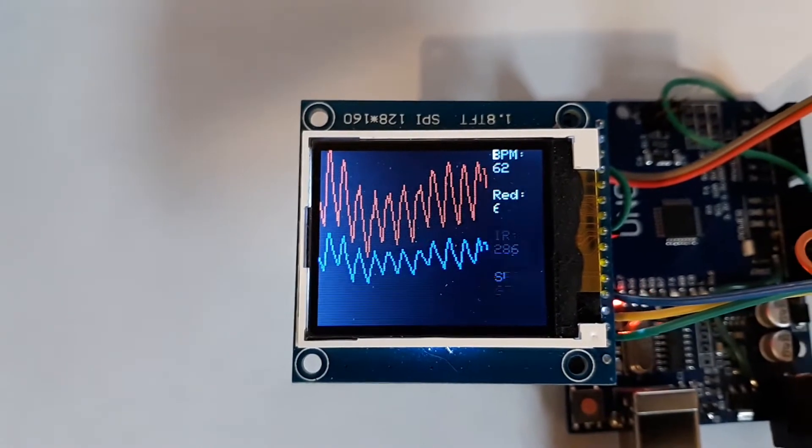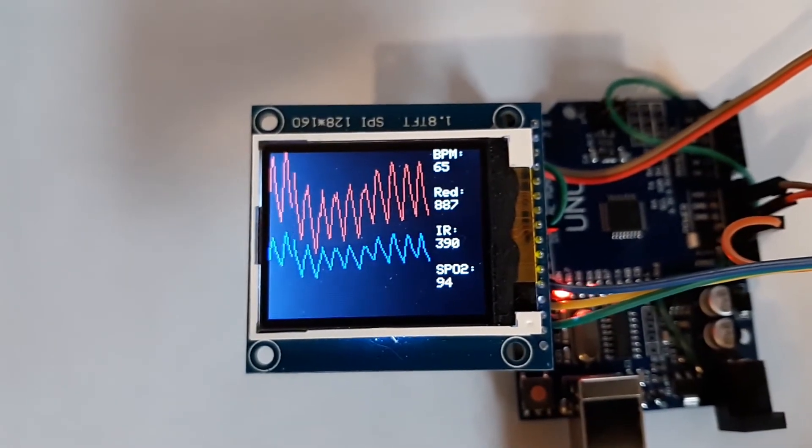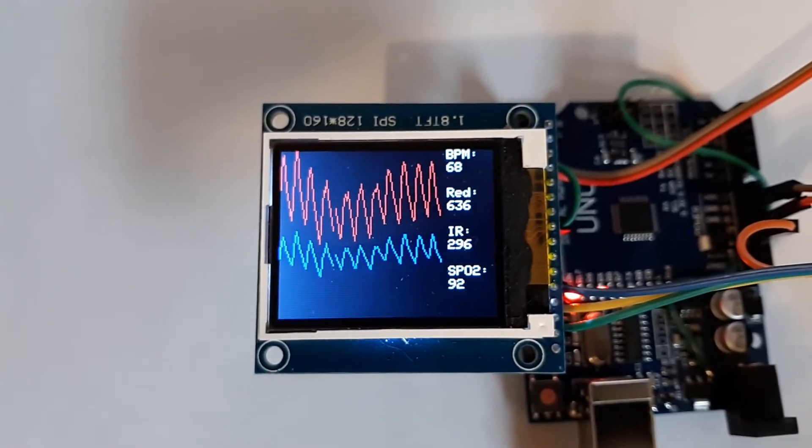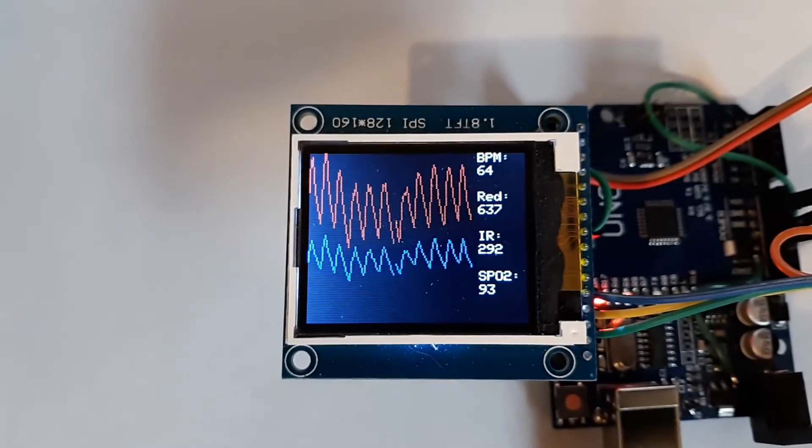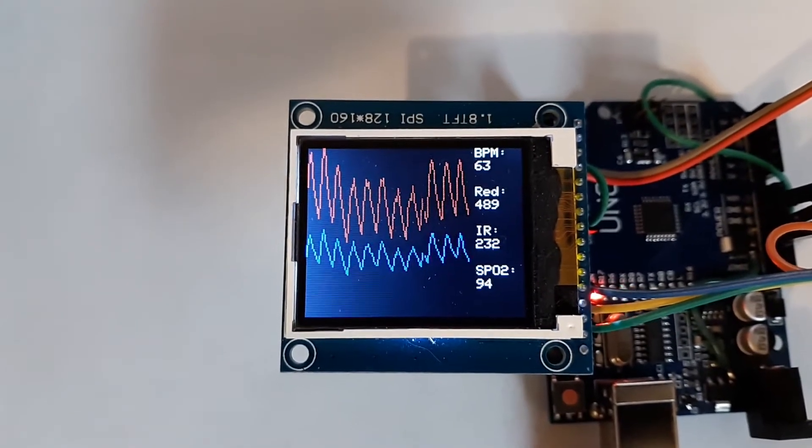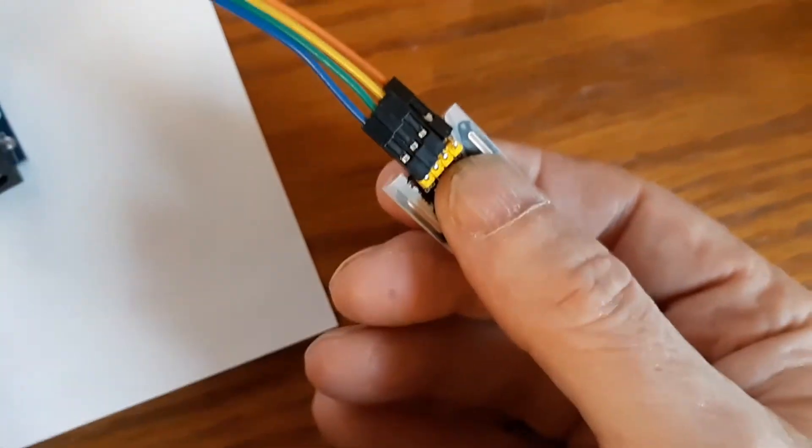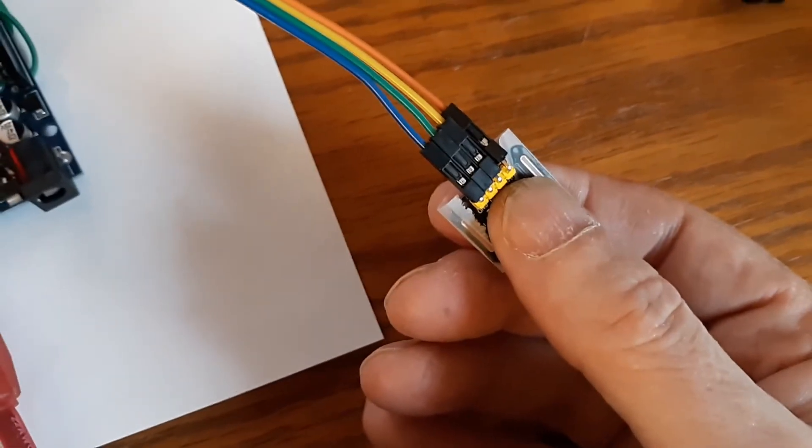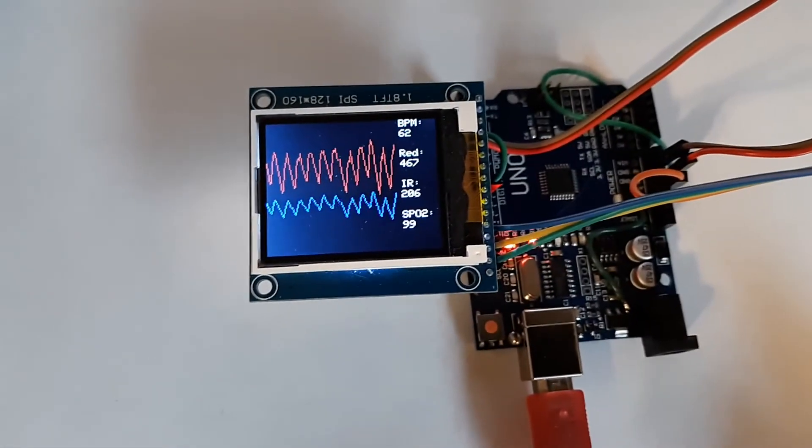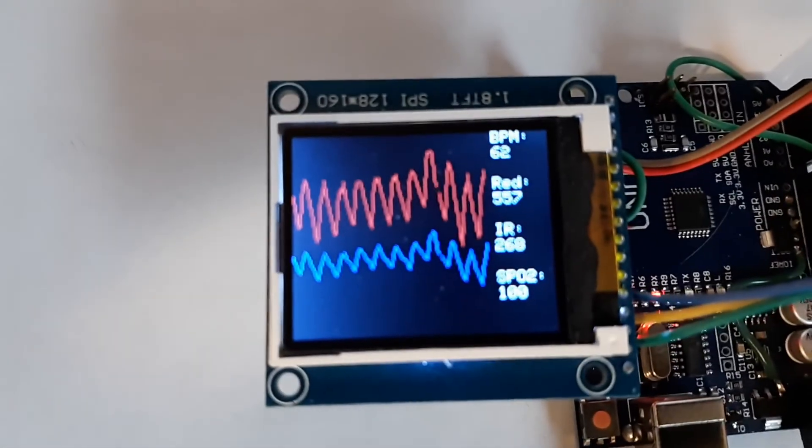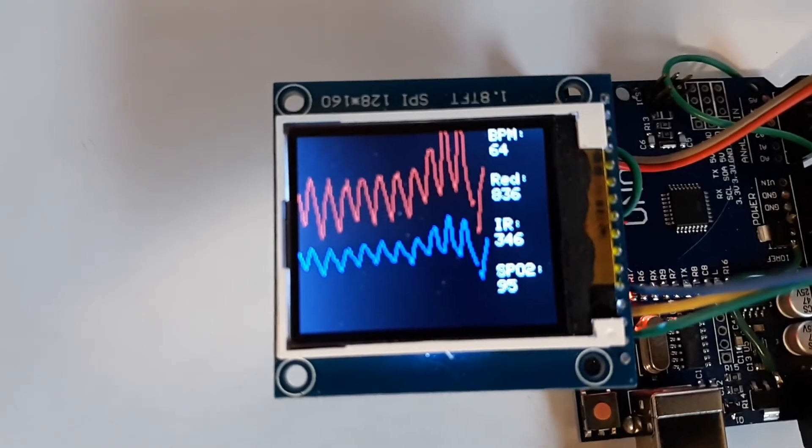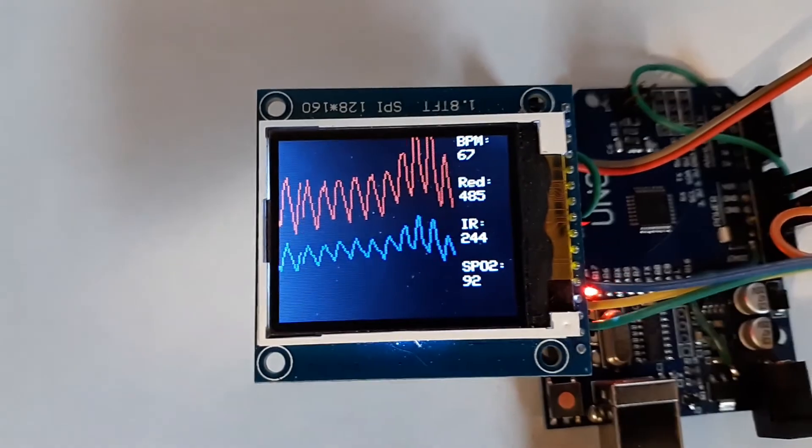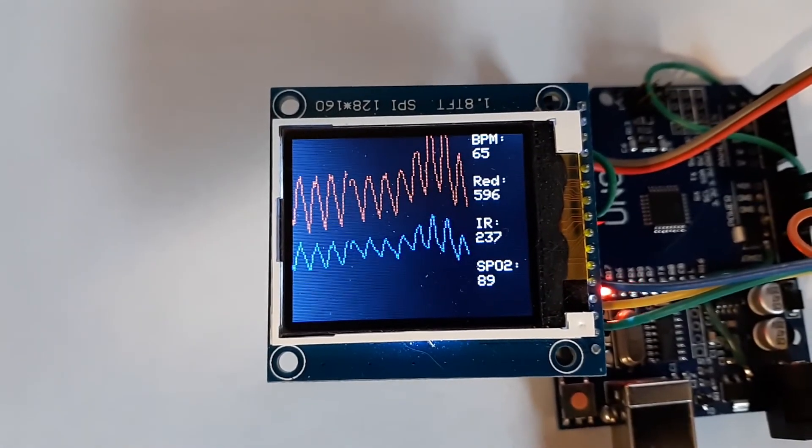So anyways, that's my own Max 30102 pulse and oxygen detection working away, holding it in my finger while the red light is going into my finger and displaying on a serial LCD screen. That's all for now.